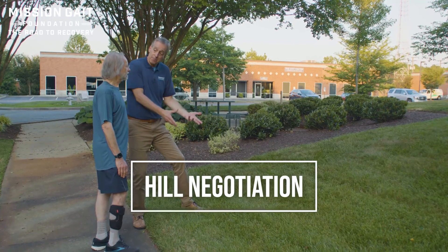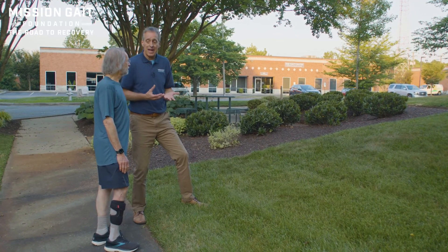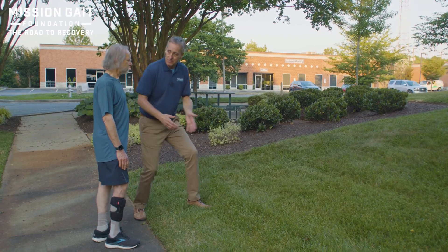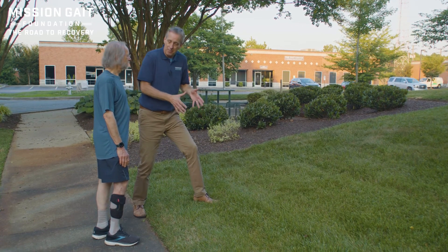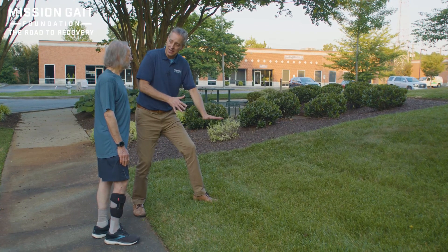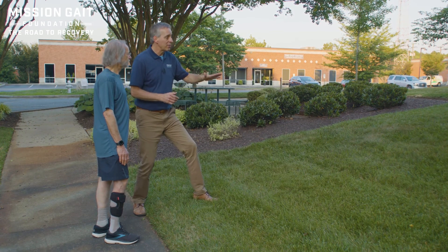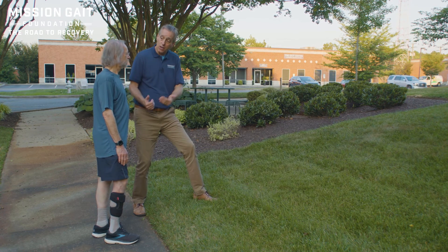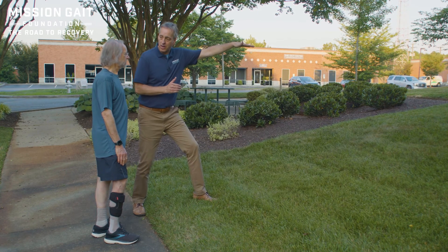When you step on grass or deep carpeting — anything that's soft — you don't want to be tentative. You want to be actually more aggressive. If you step tentatively on a soft surface, it's going to push your leg around. So when you get to a softer surface, press into the ground — make your foot adapt to the ground and stand up straight. And when you come to a steeper grade that's too steep to go up over, turn sideways, always keeping the orthotic on the low side of the hill, and sidestep up the hill until you get to a flat surface and then walk away.